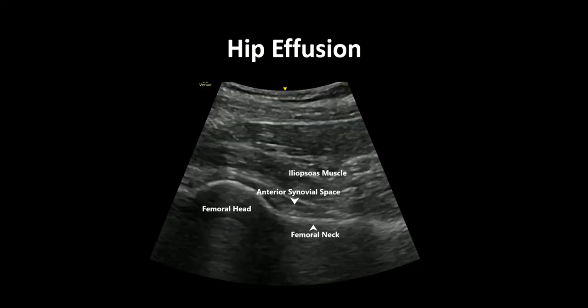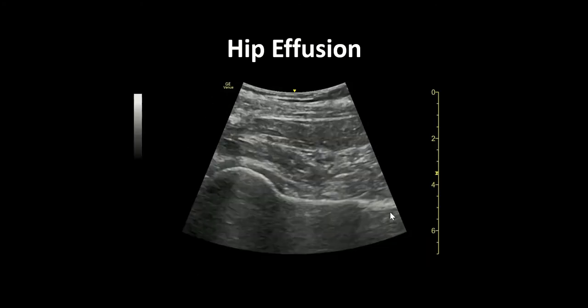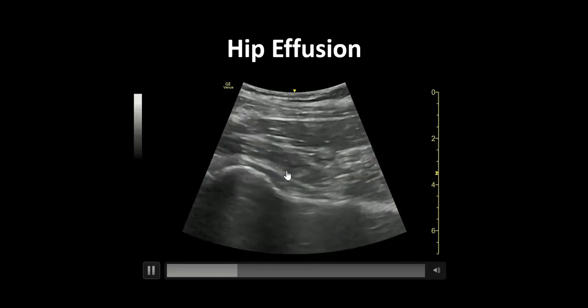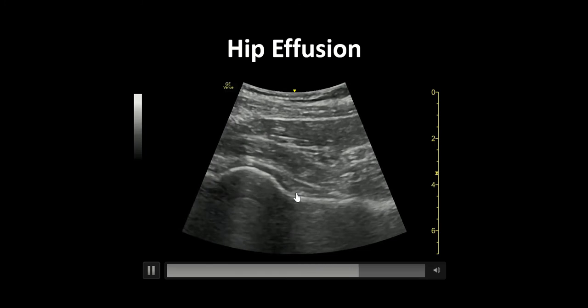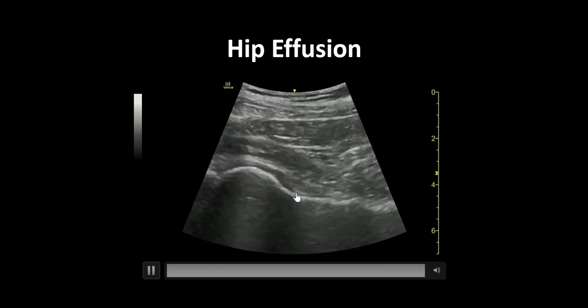Compare this image to a normal hip where there is minimal to no fluid in the anterior synovial recess. Again, we see the femoral head and neck, but an absence of fluid above the femoral neck.